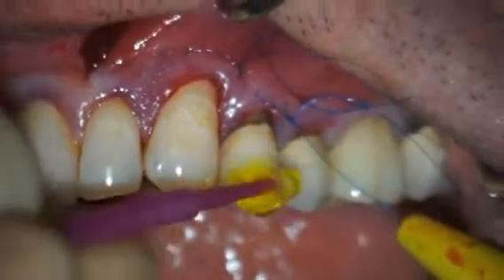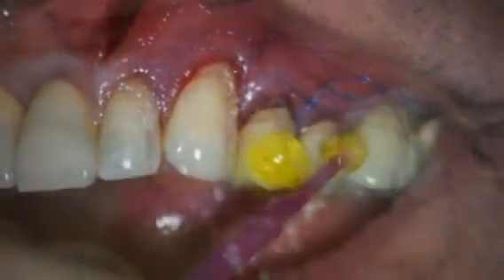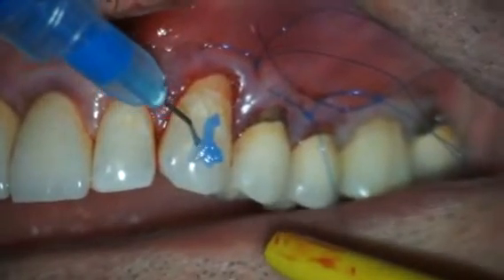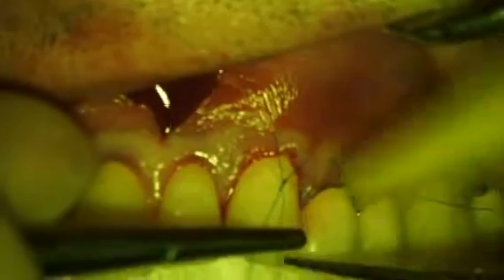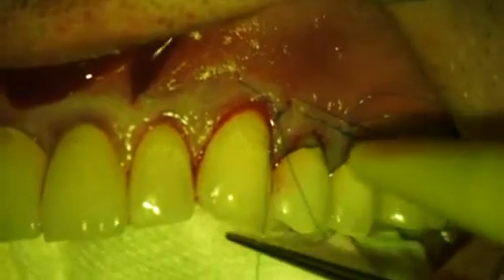Hydrofluoric acid is next carefully placed on the buccal prosthetic crown surfaces of the premolar teeth to acid etch the porcelain in preparation for bonding sutures following coronal advancement of the gingival margins. Hydrofluoric acid remains on the porcelain for approximately 1 minute, after which it is suctioned and the area irrigated with sterile saline. The facial enamel surface of the maxillary left canine is then acid etched for less than 5 seconds, then suctioned and thoroughly irrigated and dried. The gingival margin is then coronally advanced with minimal tension beyond the CEJ to the most coronal level possible of the interproximal papillae, covering the previously exposed premolar crown margins.